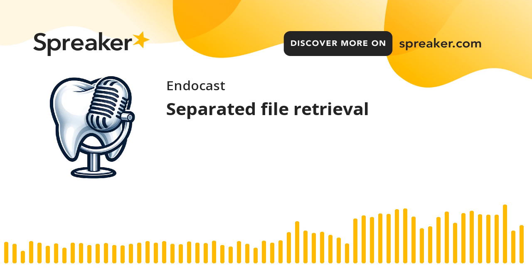Exactly, exactly. And I would like to thank you for your question because I want to highlight a very important thing. Many clinicians already know that ultrasonics could be used to retrieve the file. By vibrating the separated file, it will come out. Usually they use it without even magnification, without the ability to see the file or trying to make it visible.